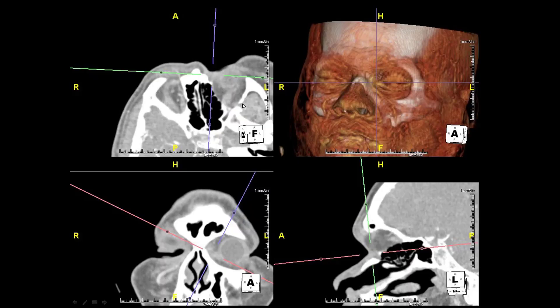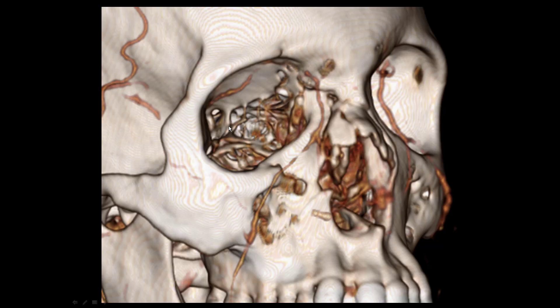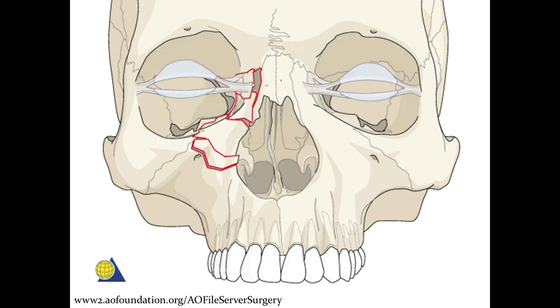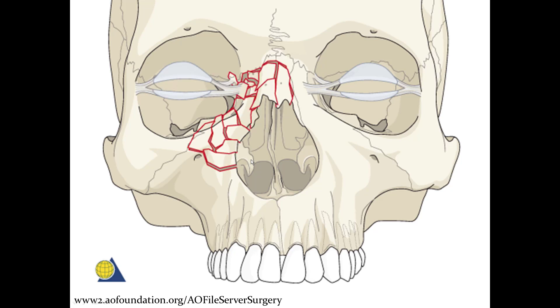Here are 3D reconstructed images and MPRs showing where the medial canthus tendon inserts. I like to use 3D reconstructions to best illustrate fractures. A type 1 Markowitz would have a large fracture fragment with no problem with tendon insertion. A type 2 has a large fragment where you don't have to reattach the tendon itself — you just reattach the segment of bone and restore function. If it's highly comminuted, more complex repairs are required to attach the tendon.